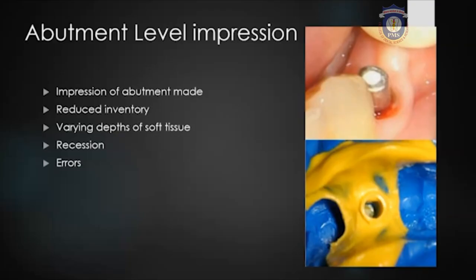As you know, the implant is placed subgingivally within bone, so we are not able to capture a majority of the portion of the abutment which is within the gingiva. This will lead to reduced surface for retention, and also the crown will not have a proper margin.